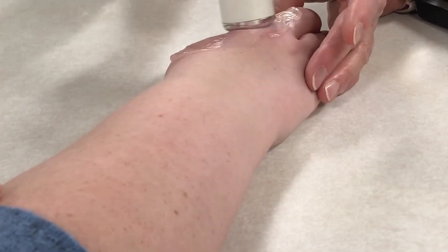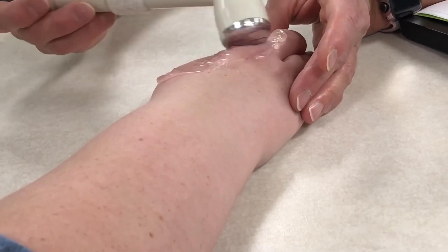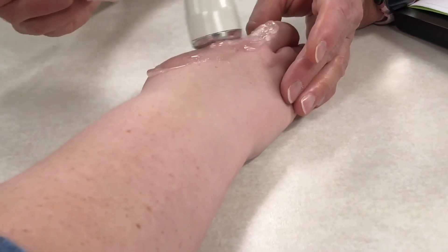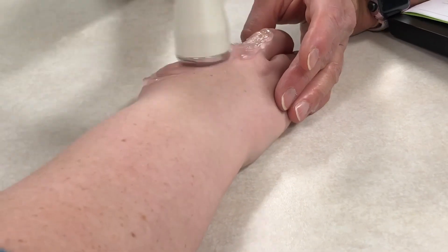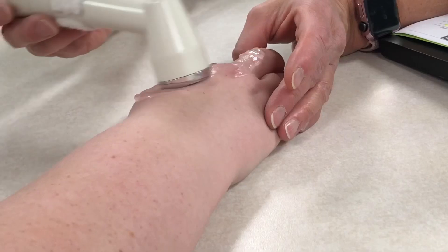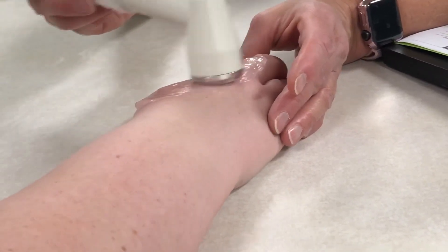So far I have noticed a pretty big difference in how my scar looks, even after just the first session. It's not painful — it just gets warm and feels good in the moment. I did feel a little sore the day after, especially the morning after, but that's nothing that Advil couldn't fix.